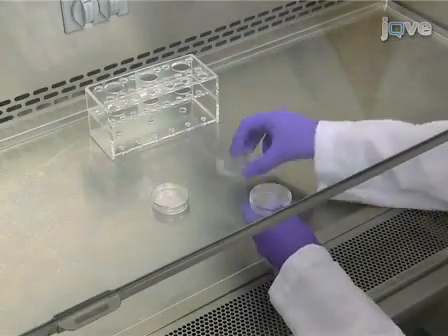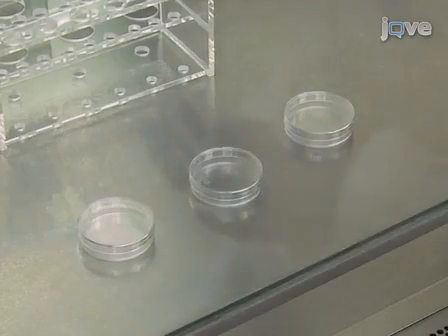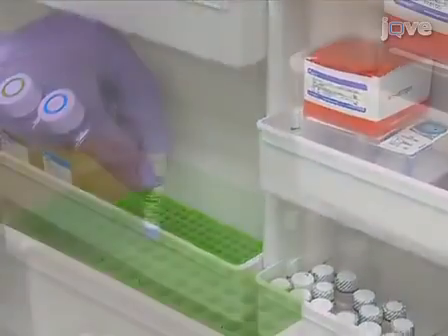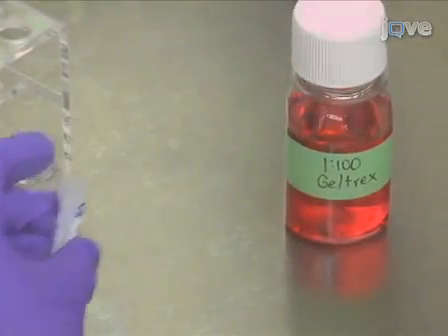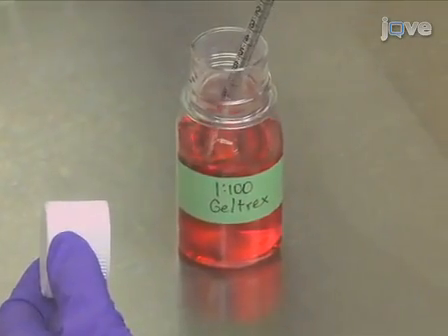Geltrex-coated culture dishes are required for adapting and passaging human-induced pluripotent stem cells in feeder-free conditions. One day prior to the preparation of these coated dishes, thaw one tube of Geltrex slowly by leaving it in the refrigerator overnight. On the following day, dilute the tube of thawed Geltrex 1:100 in basal medium by transferring 1 milliliter of Geltrex to a bottle containing 99 milliliters of basal.